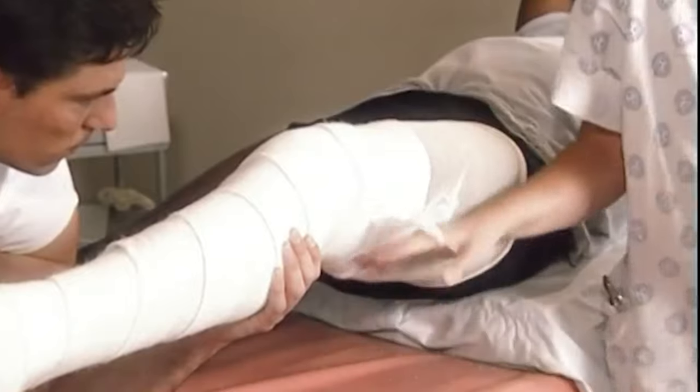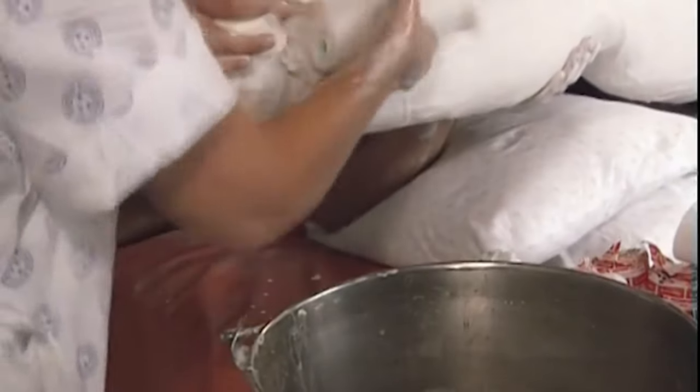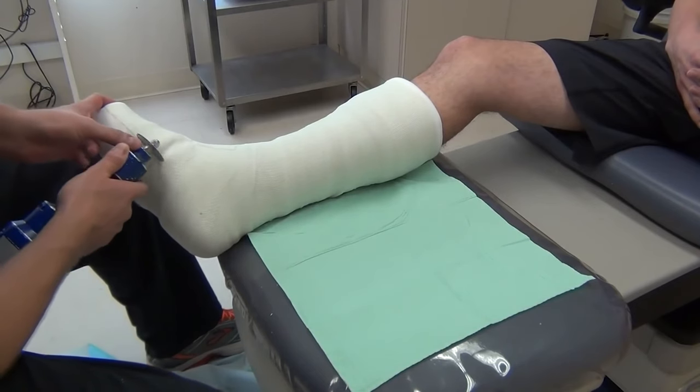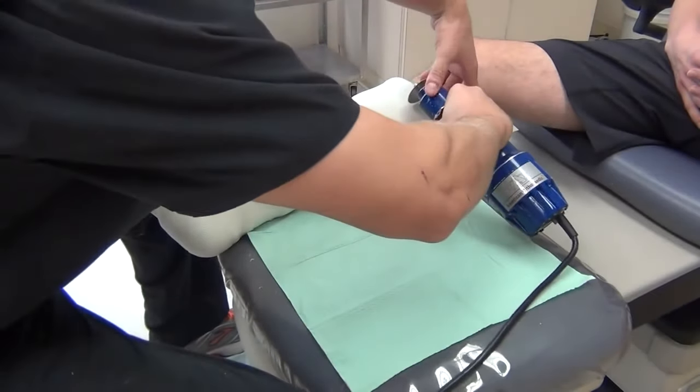The modern plaster cast is a hygroscopic bandage that has been sprinkled with gypsum plaster. The plaster is produced industrially, packed and then sealed. When soaked in water, the gypsum plaster begins to harden. Applying a plaster cast can take up to 45 minutes, and a full cast can take from 24 to 72 hours. Removing a plaster cast is also a complex procedure. The hardened plaster can only be safely broken with a special electric saw.